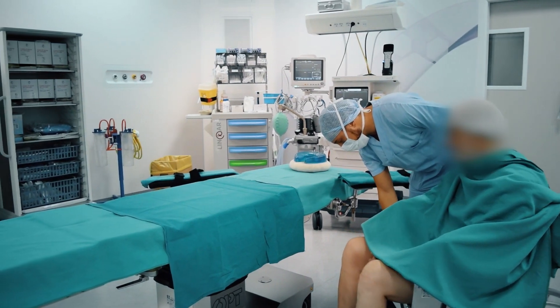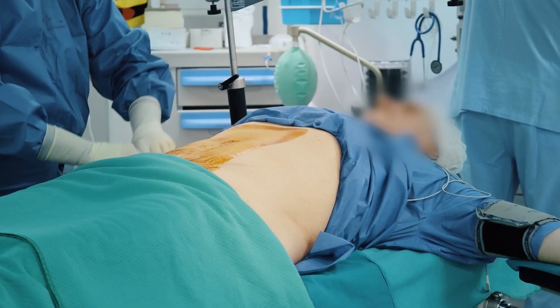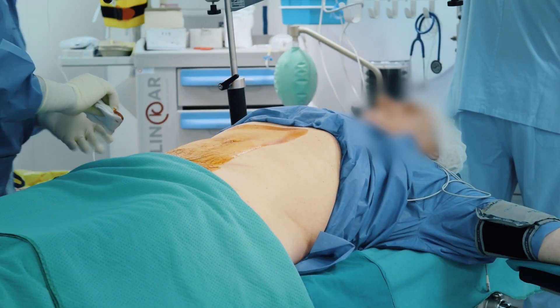Adipose tissue can be harvested with a small liposuction from subcutaneous fat. The technique can be executed using local anesthesia; however, a mild sedation may be required.